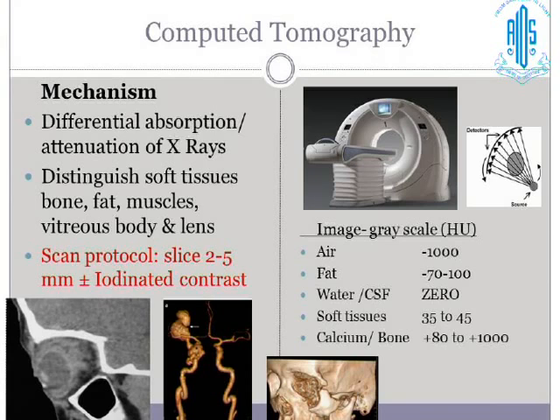And not just this, we also can now produce images which are not just axial alone. We can produce sagittal, coronal, even curved images. This is a parasagittal image, CT angiogram, and volume rendered image. All is possible on CT.